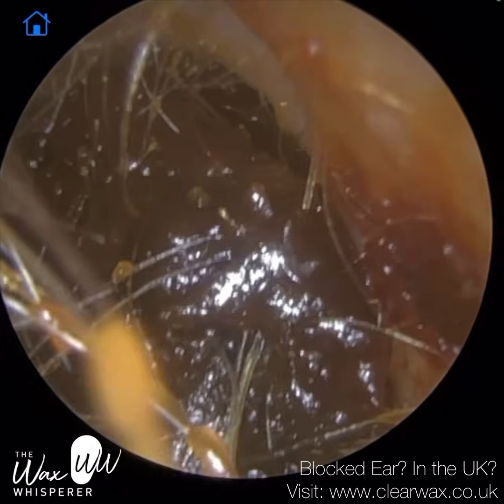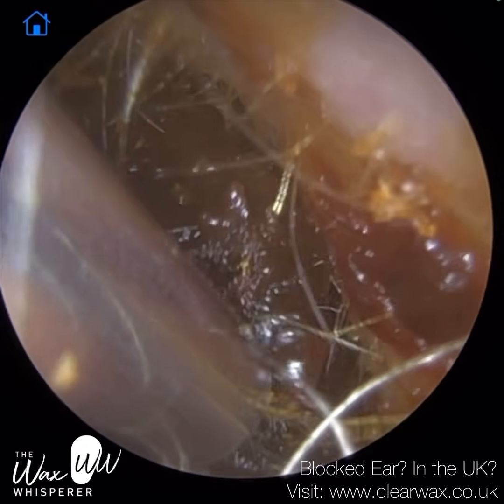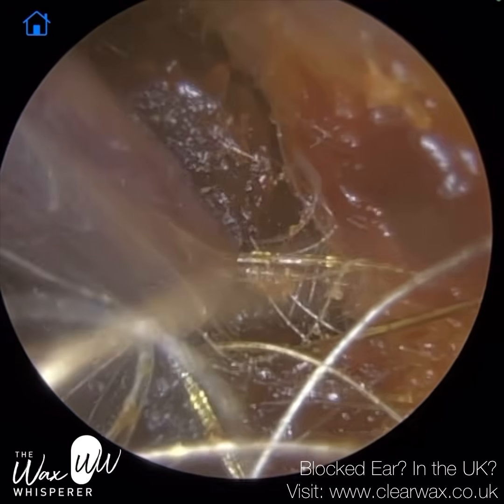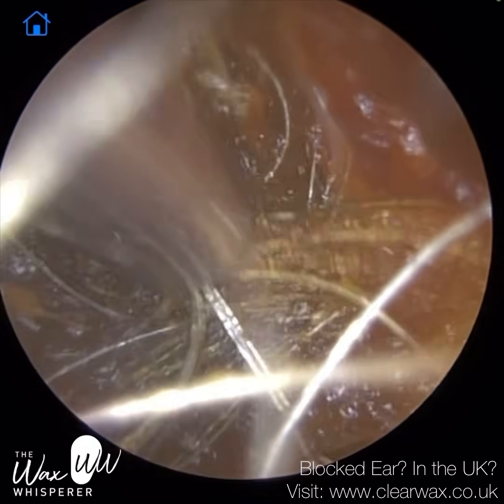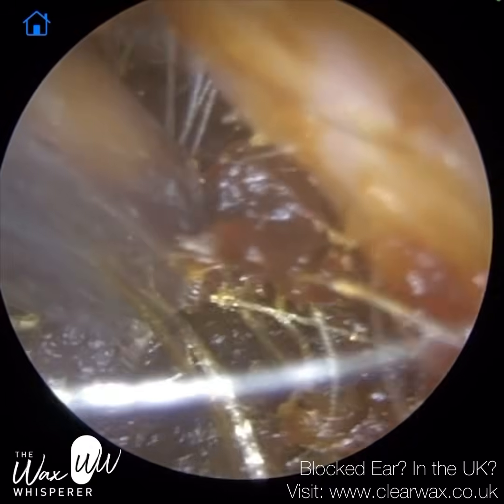I have a couple of patients for you in this video, and this is patient 1, and we are performing earwax removal in their right ear. And this earwax extends from the entrance of the patient's ear canal all the way to their eardrum. And as you can see, the earwax is matted. There's a lot of loose hair strands in there.